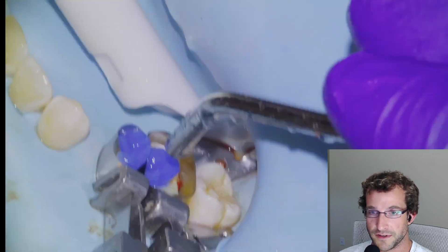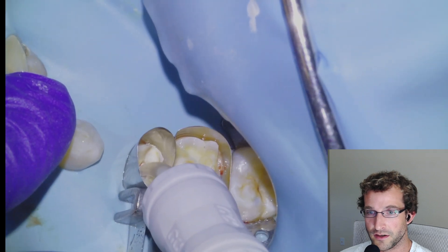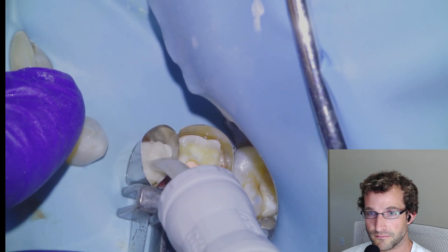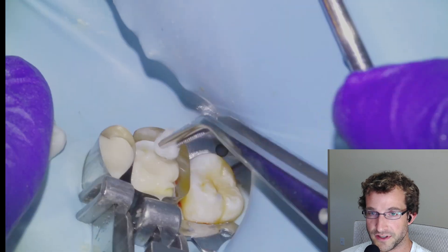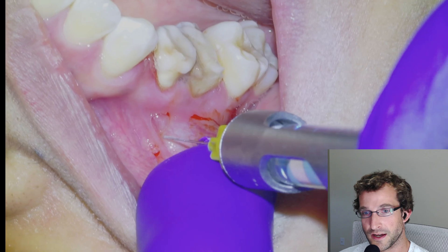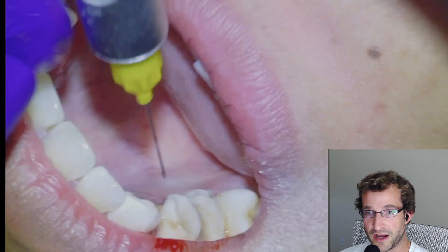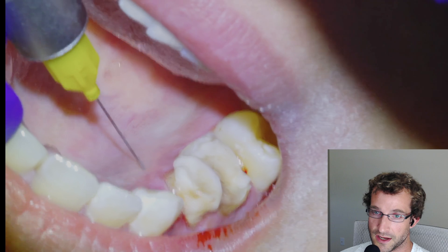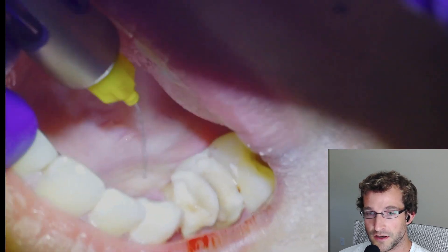We'll etch for five seconds, rinse, dry, and then apply our Equia Forte. We'll use two capsules and pack it in with a cotton pellet, leave it for five minutes. Then we're going to refreeze before we start prepping because we'll be packing cord or using an electrocautery unit — I think we used the electrocautery for this one.